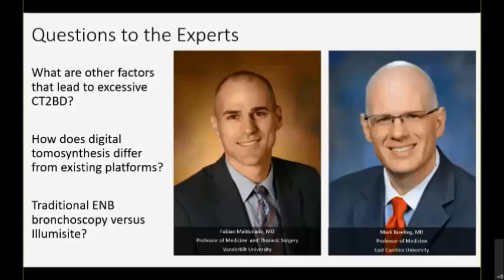But I would say that these are few and far between, and the vast majority of the time there's some airway out there that's close enough. So for the study, we said if there's an airway within 3 centimeters of the nodule, this is a good case for bronchoscopy because we can align ourselves and deploy that needle. In many cases you don't get a radial ultrasound view at all, because you need a few alveoli filled with air to lose your radial vision. But once you've passed that needle into the nodule, you create a path that your radial probe can follow, and not uncommonly we'll see the nodule afterwards.